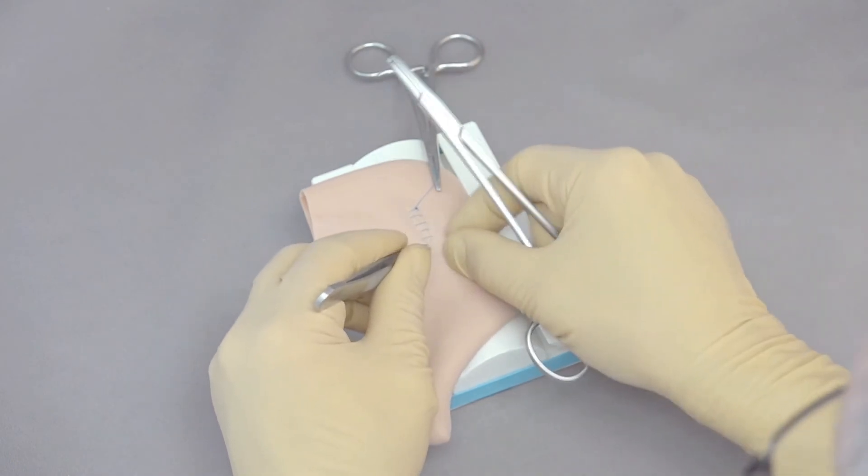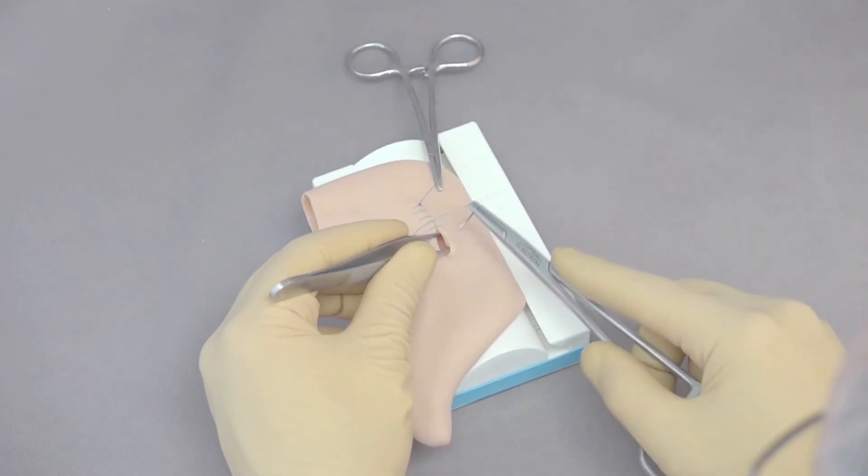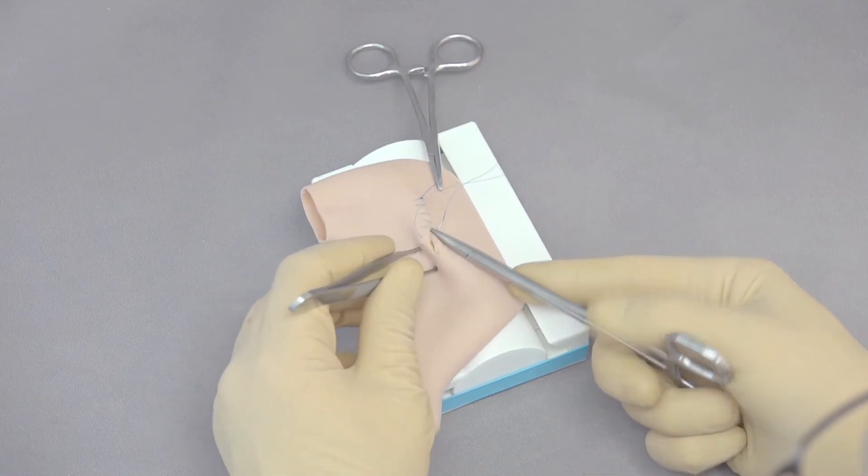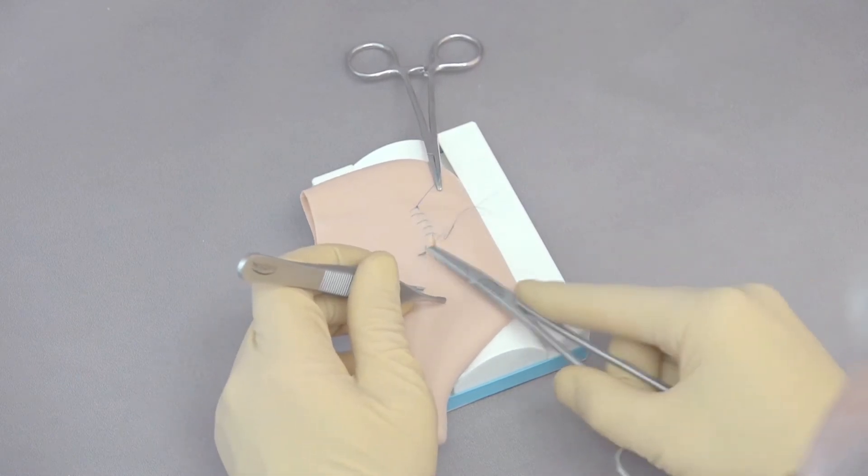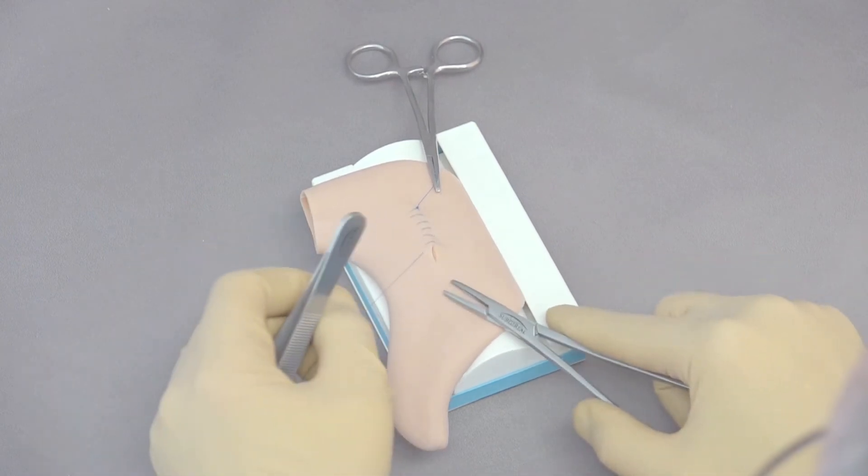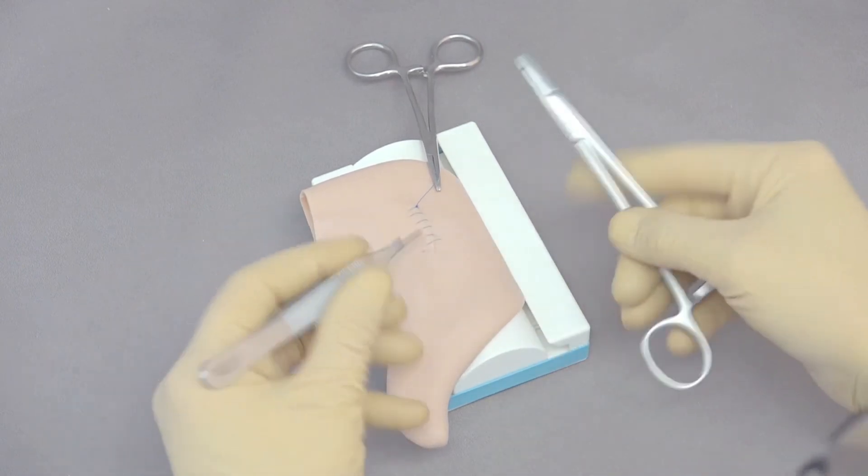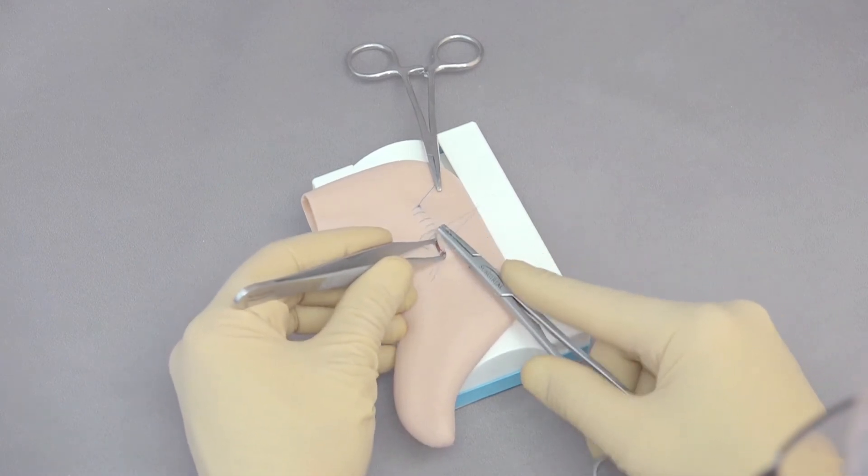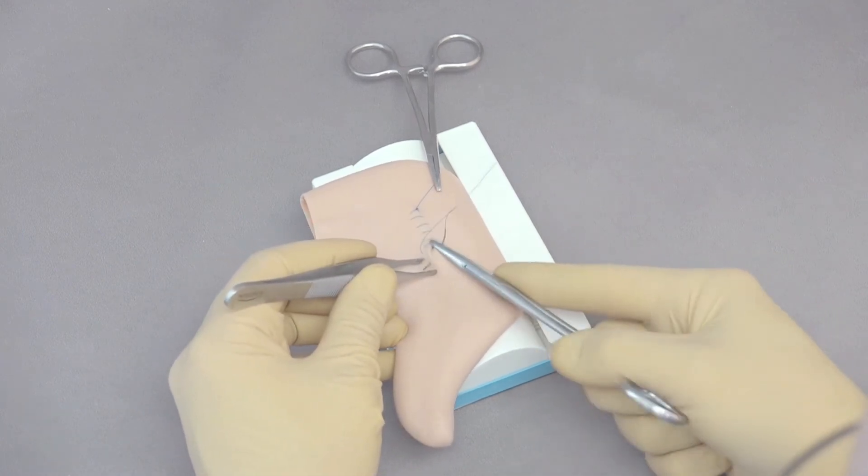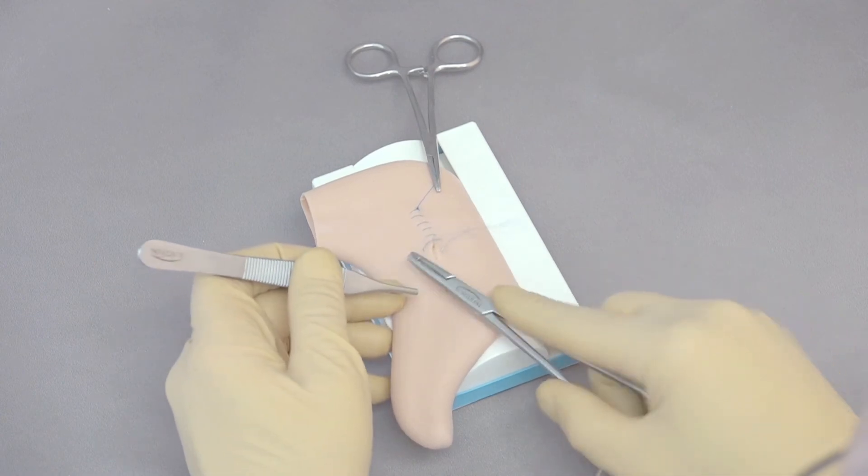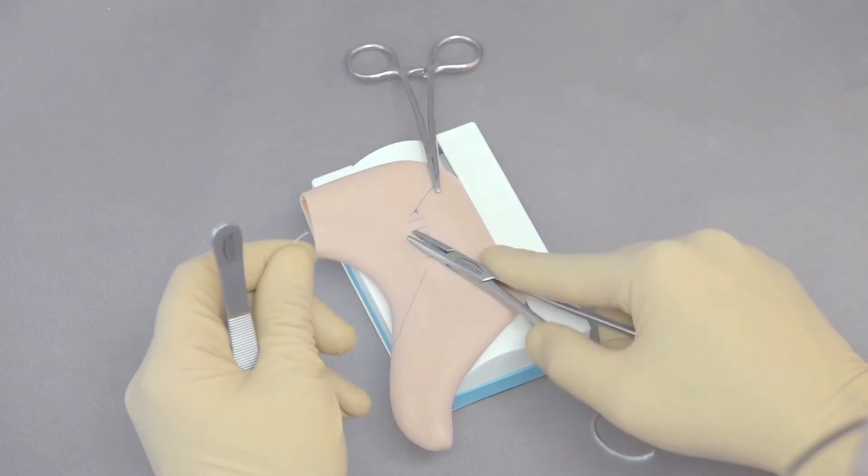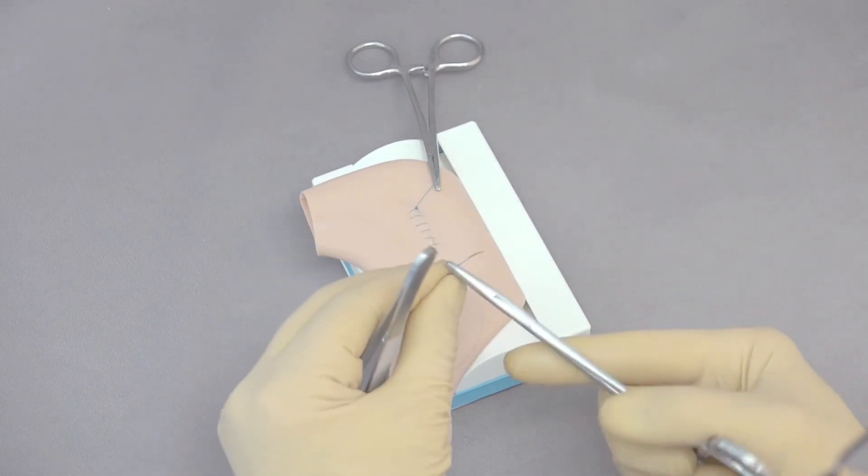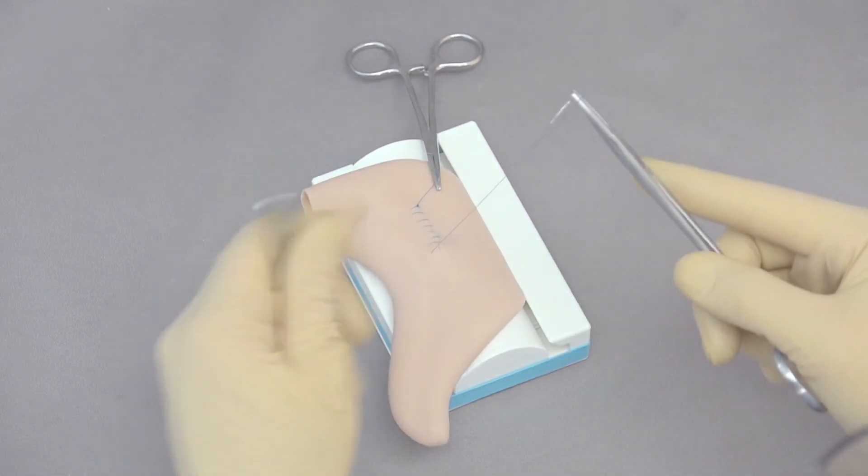It's important when you do this to make sure that you don't get the other side. So I put my thumb forceps in here to separate that, and then I think one more suture ought to take care of this. Maybe two. Got a couple more spaces here to work on. You can see that's coming together nicely, supporting itself.